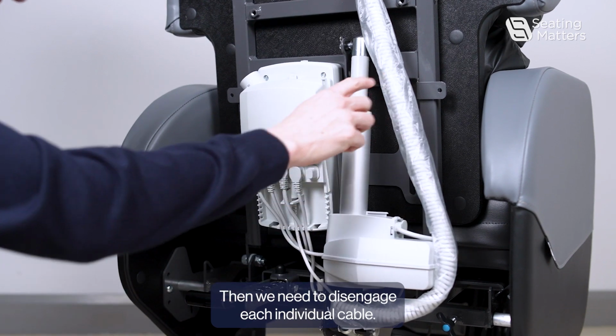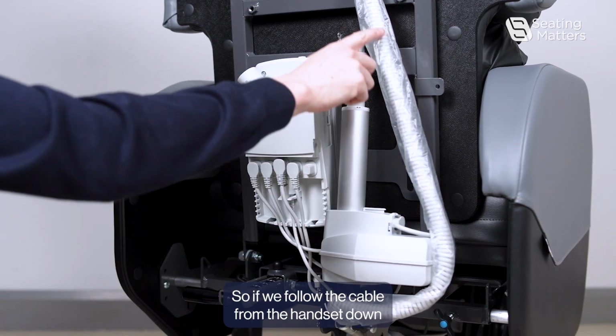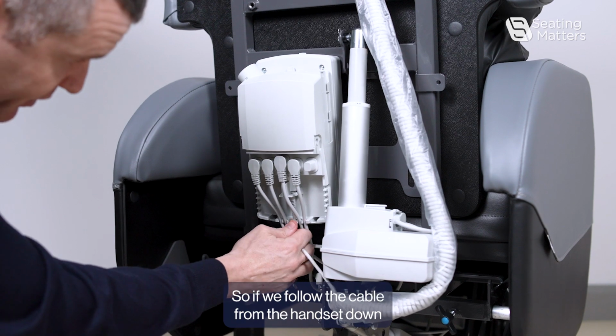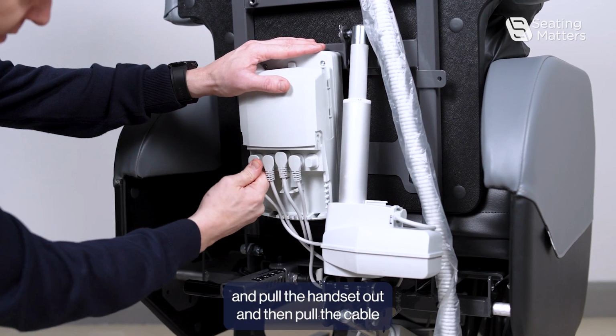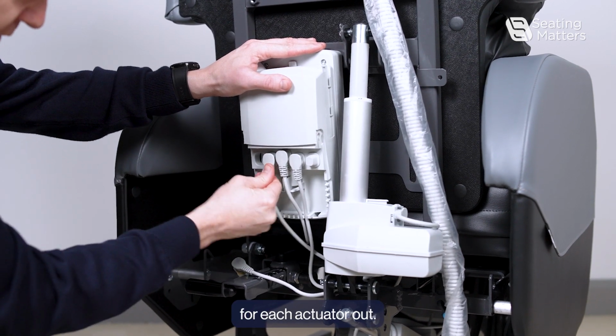Then we need to disengage each individual cable. So if we follow the cable from the handset down and pull the handset out, and then pull the cable for each actuator out.